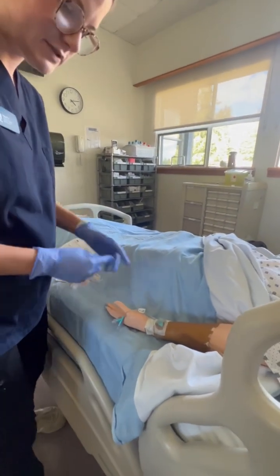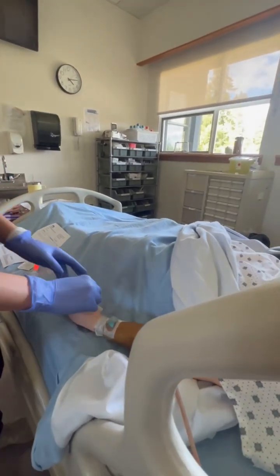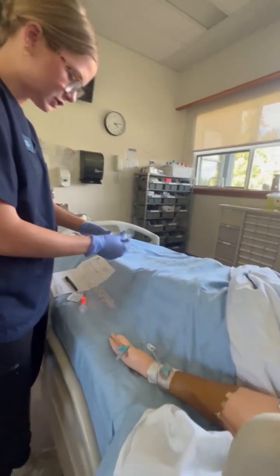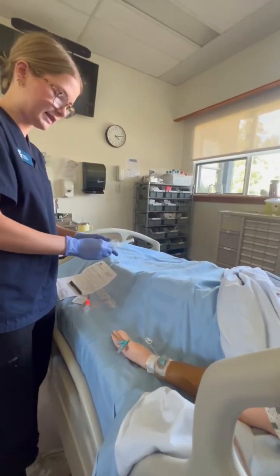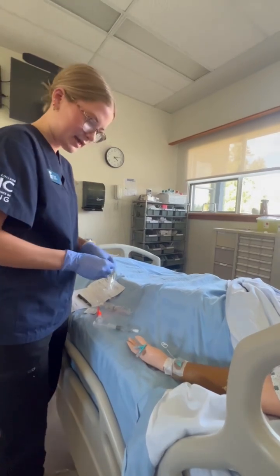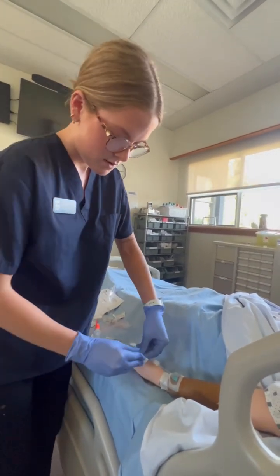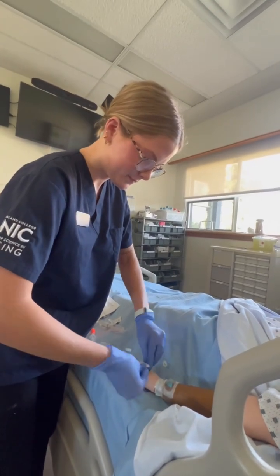All right, so I have an intermittent infusion device here. I'm going to unclamp it, and I am going to prepare my normal saline here. Have it right there, and I am going to clean the port.